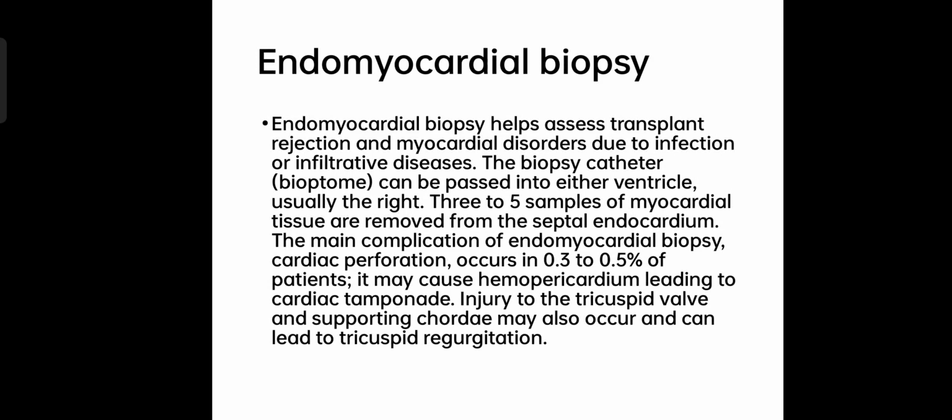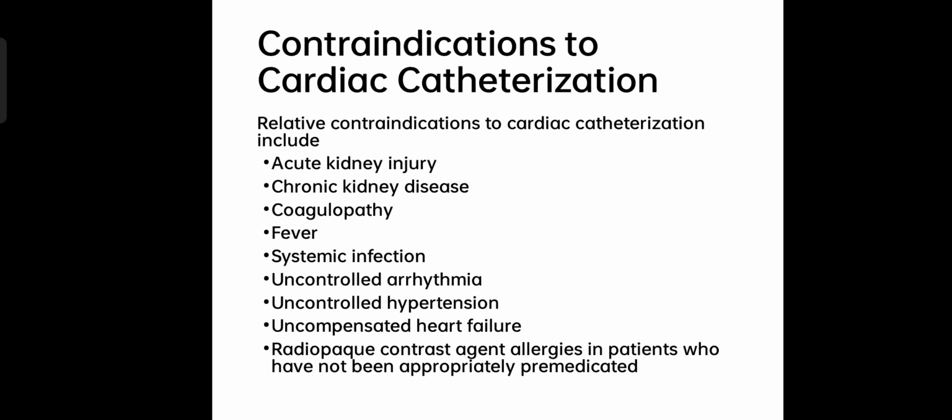The main complication of endomyocardial biopsy, cardiac perforation, occurs in 0.3 to 0.5% of patients. It may cause hemopericardium leading to cardiac tamponade. Injury to the tricuspid valve and supporting chordae may also occur and can lead to tricuspid regurgitation.